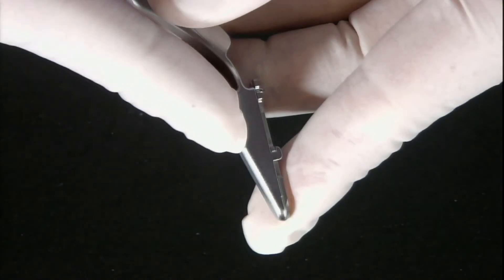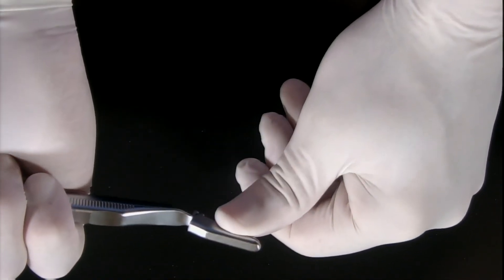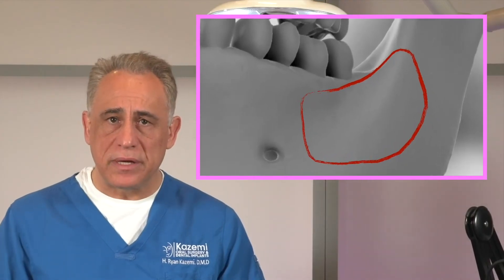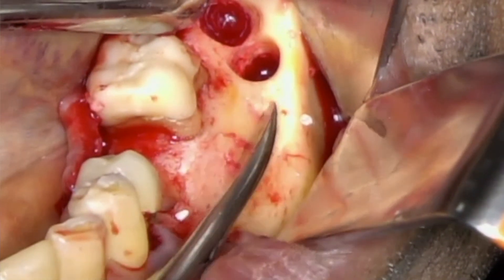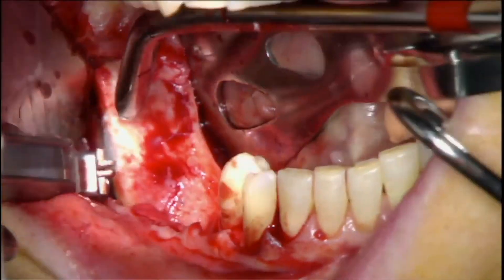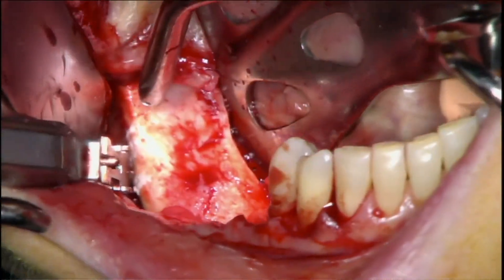How you hold the handle and the amount of load you exert is important in how well and how fast you can harvest the bone. If the bone is quite soft, hold the instrument with your palm down and index finger on top to exert a moderate amount of load. For harder bone, hold the instrument with your palm up as if holding a spear, and use your forearm and arm to place a larger amount of load on the blade. A great donor site is the lateral aspect of the ramus to the second molar area along the external oblique ridge — place the scraper against the lateral wall of the mandible and harvest the bone with an upward motion.